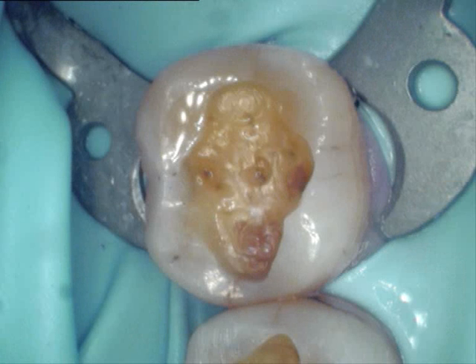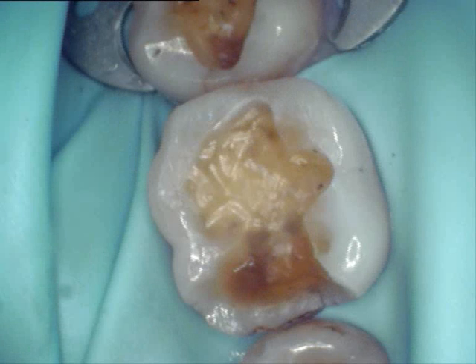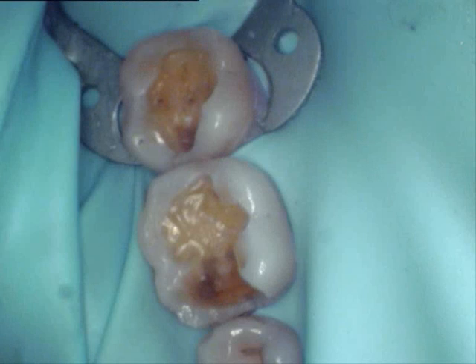You can see the rubber dam in place here and you can see the amalgam being removed by the dental drill. The patient has had no discomfort because they're anaesthetised and there's no debris going in their mouth. You can see the teeth partly prepared where all the decay and amalgam have been removed, and then we move to the next stage of preparation.